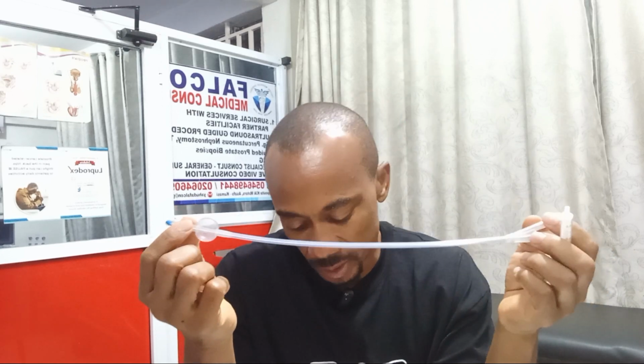I've done it a few times, but the reason why I'm not too comfortable with that is because sometimes the valve itself might be damaged after the attending physician or the nurse has forcefully pushed the syringe into the valve to try and deflate. There is this white hard plastic component of the valve, which if you force it downwards can cause damage. And so the valve mechanism probably will not even be available for you to hyperinflate. So that hyperinflation technique might not even work.